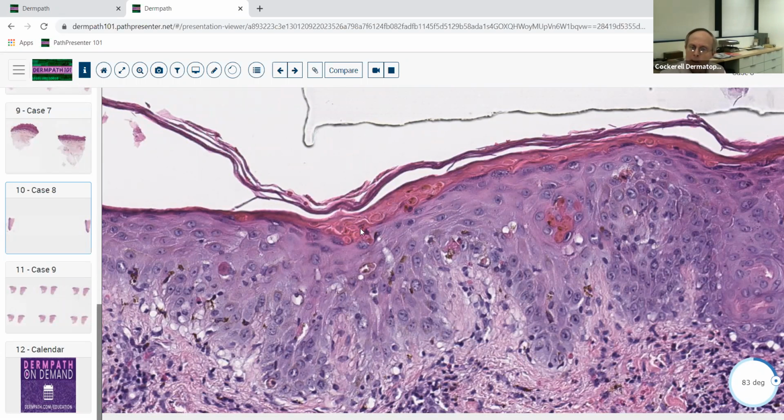You've got all these necrotic keratinocytes sitting in what looks like the cornified layer, and that's not parakeratosis. When you see necrotic keratinocytes in the cornified layer, that is not parakeratosis. That's actually sloughing and transepidermal elimination of necrotic epidermis. So really, if you're a purist, it's a form of an eschar. So this epidermis was probably mostly all necrotic.